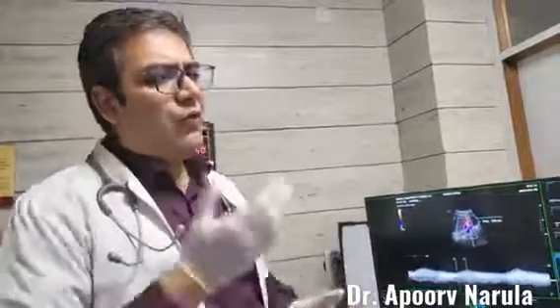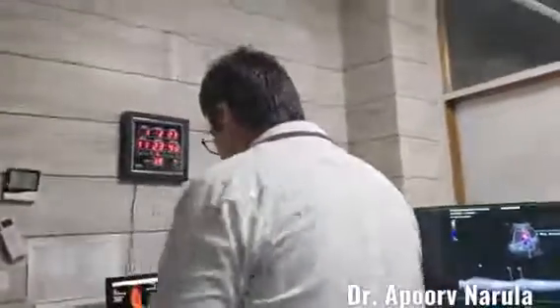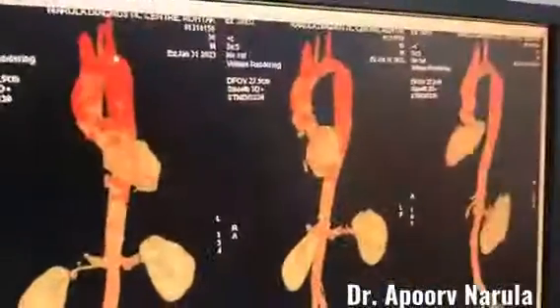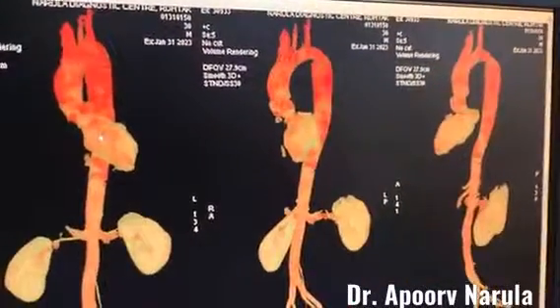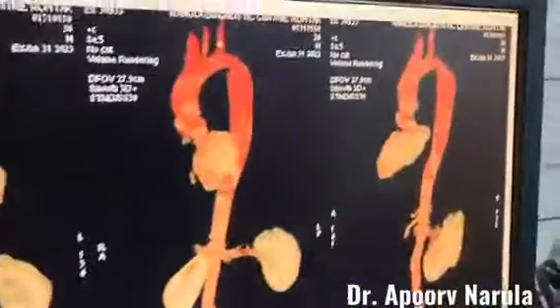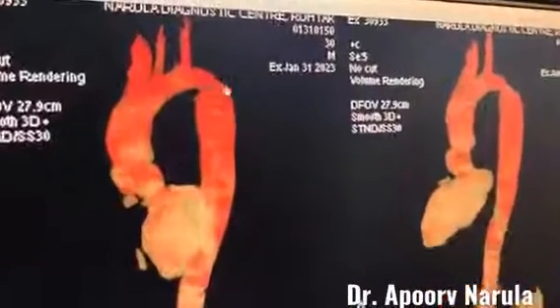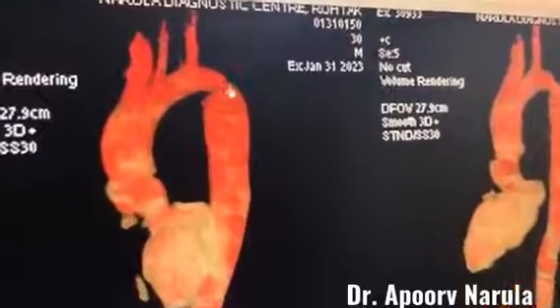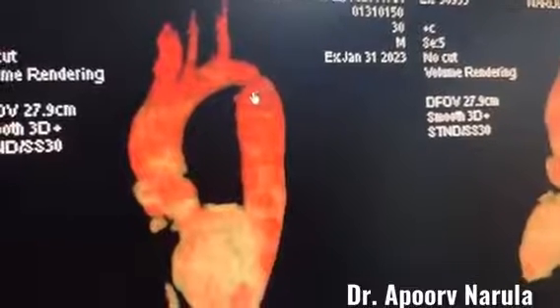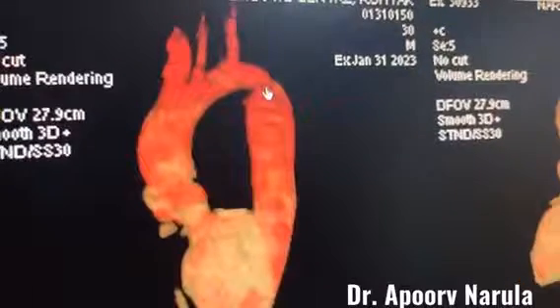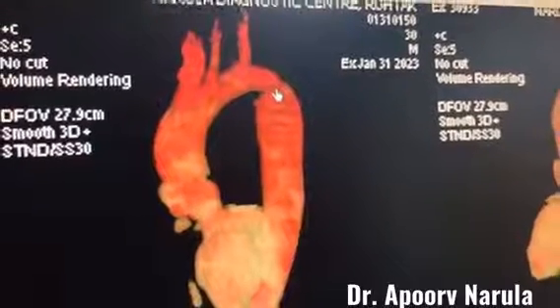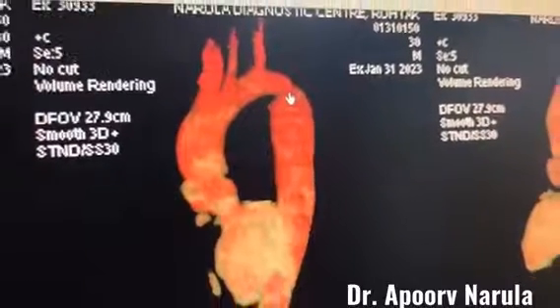The angiography was done, and these are the beautiful angiography images that you can see, starting from the origin to the bifurcation of the aorta. What we saw was there was a narrowing at the level of the arch of aorta, distal to the origin of the left subclavian artery. So this was a post-ductal type of coarctation of aorta. We made the diagnosis, and the patient now needs further management for this.